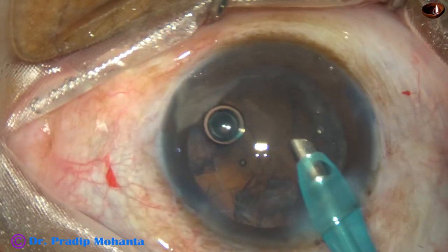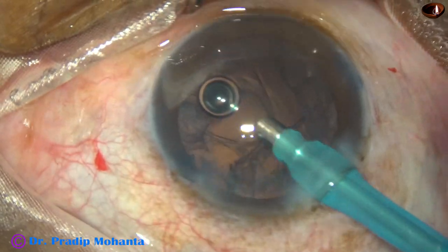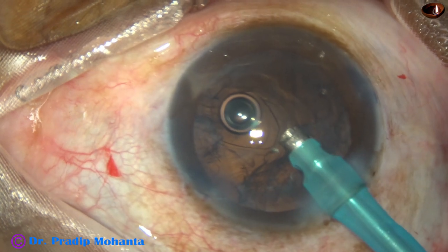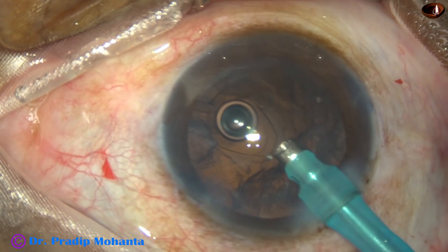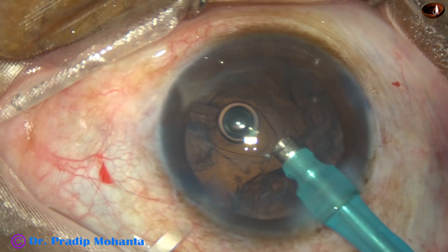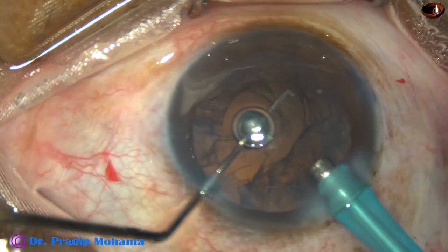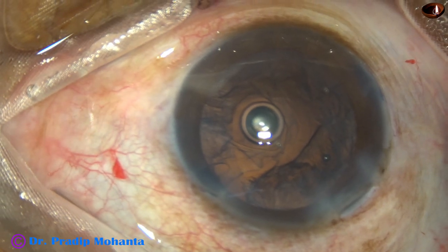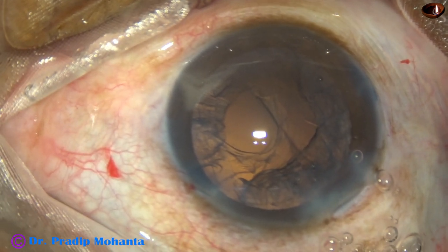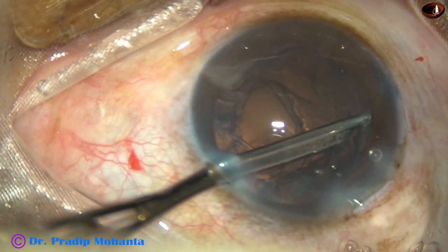Taking care not to attract vitreous. Here I can make out that some vitreous strands have come into the aspiration port — so I stand still, take a hook, take my small chopper, go through the side port, and pull those strands out.